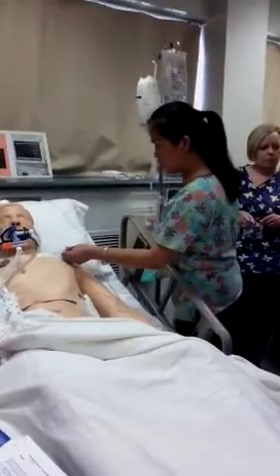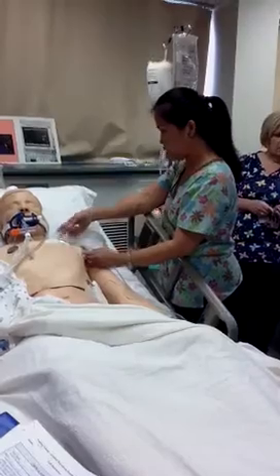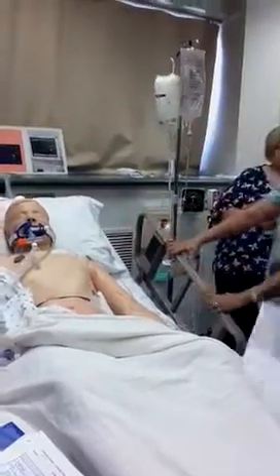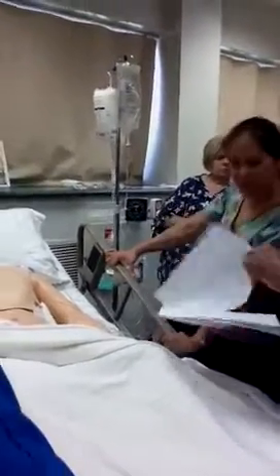I want to make sure that these are all capped. And this one's capped. Question on that one? Anything else that they have? After you have done this for a long time, it's like, okay, are we forgetting something?